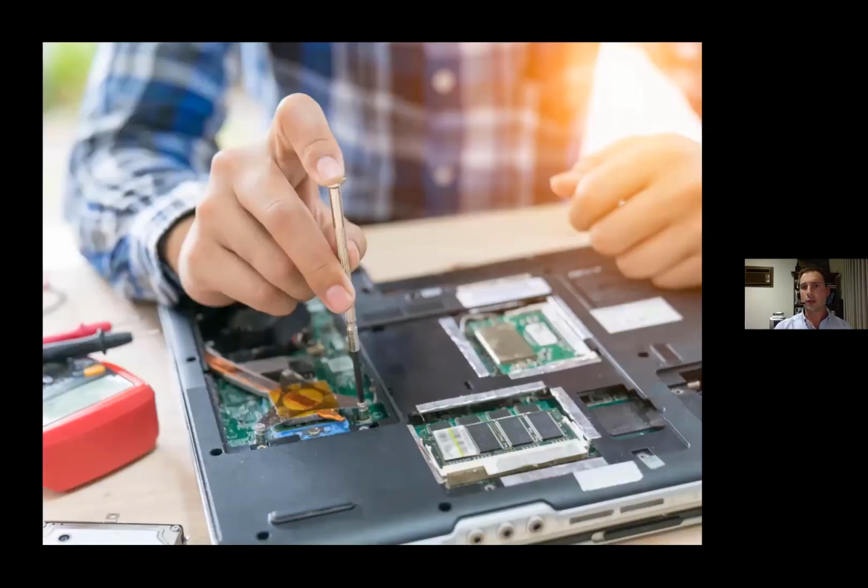The other thing in terms of the hardware, this takes longer. So I'll tell patients that first off, what you'll feel is that after this treatment, and I'll change this depending on what specific condition I'm treating. So for example, Achilles insertional tendinopathy, it doesn't respond as quick as mid-portion does. So you have to factor that into the way you set the patient's expectations.